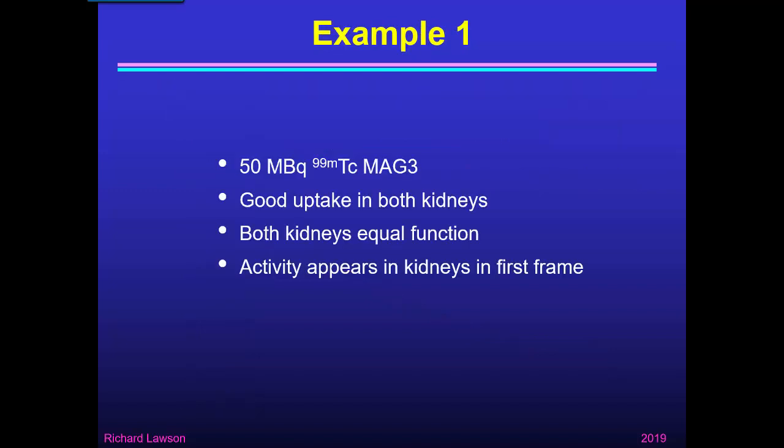My first example is from a patient using 50 MBq of Technetium-99m-labelled MAG3. This patient has good uptake in both kidneys, and both kidneys have equal function. In this study, the activity appears in the kidneys in the first frame, so we have no problem about the delay.